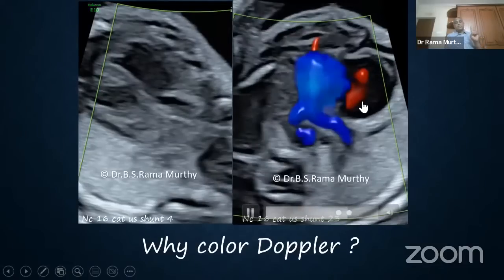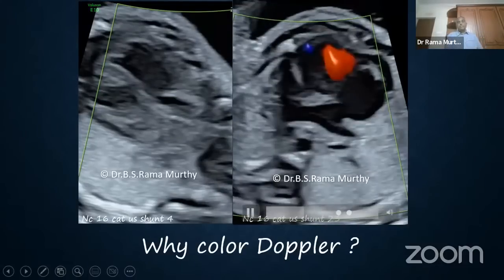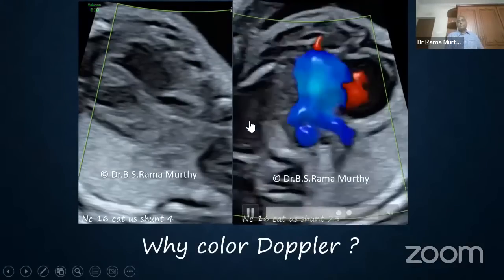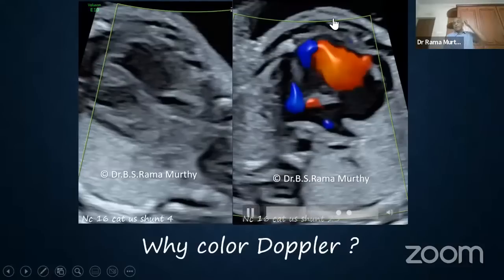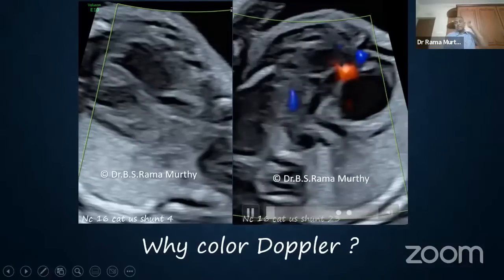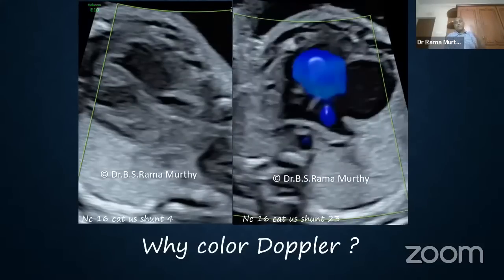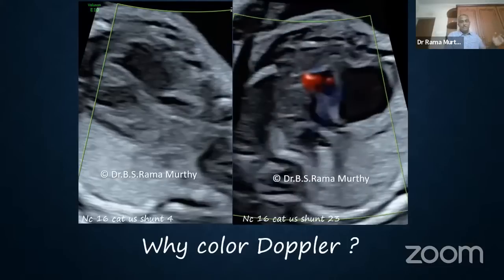So these are the two reasons why I will do a Doppler of the great arteries. And notwithstanding that, I will also look for truncal regurgitation, because the truncal valve is a dysplastic valve. That is why it is thick, and when the valve is dysplastic, it can regurgitate. Now let's move on to the next.